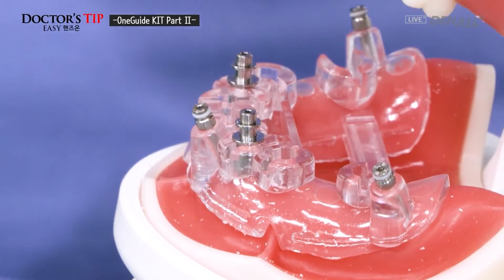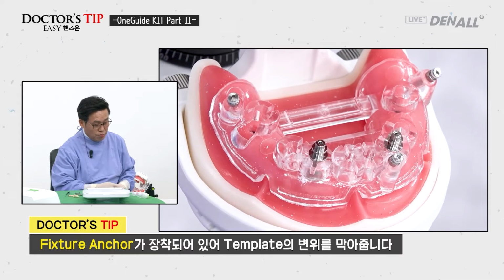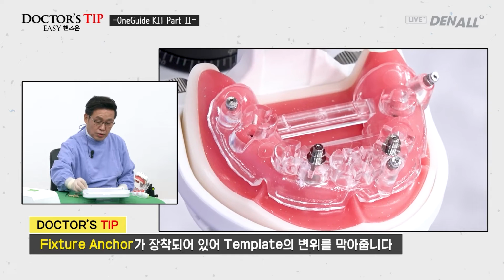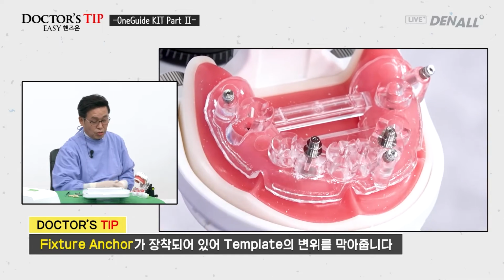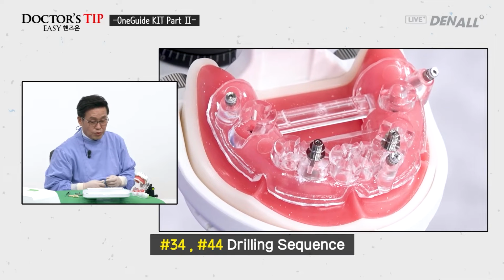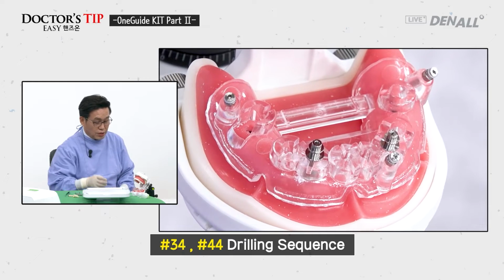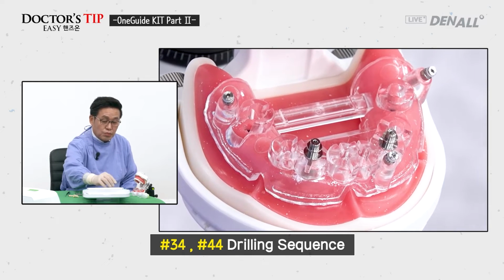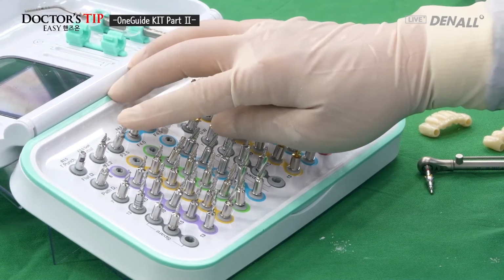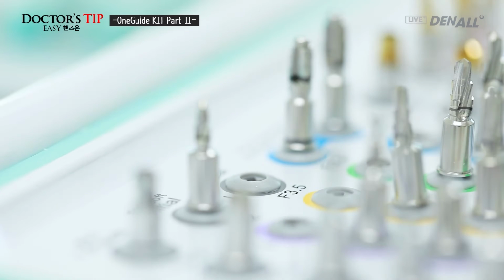Vertical anchor on both sides have been removed, but on number 36, 2 implants have been placed and fixture anchor is connected, so the stent does not move. At this stage, on number 44 and 34, 4.5 by 10 millimeter implant is going to be placed, and the 3.5 initial drill is chosen again. 5.1 hole, regular size.